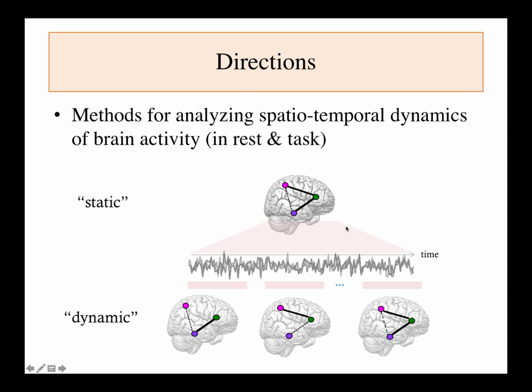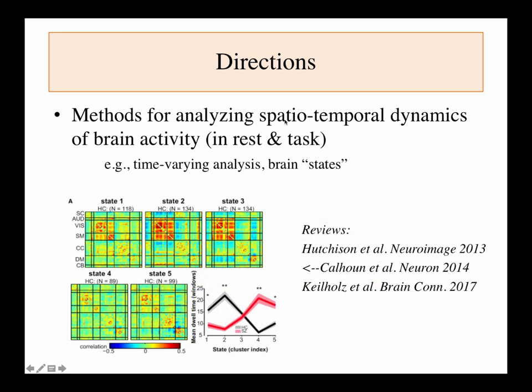So instead of just making one summary map of the data over a whole scan, which is typically done, if we take smaller chunks of data and look at how features vary across the scan, could that give us perhaps any additional insight into either brain network function or cognitive states or brain disorders, for example?